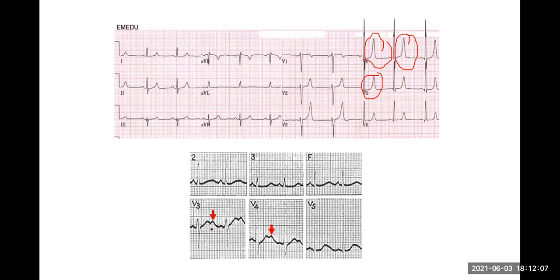Now, in this ECG, you can see another sort of wave after the T wave. What is that? That is a U wave, which occurs in patients with low potassium levels, hypokalemia. So in the T wave, you are looking for T inversions, you are looking for tall tented T waves of hyperkalemia. And then if you get another positive wave after the T wave, that is hypokalemia, and it's called a U wave.